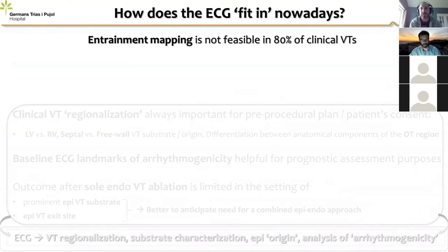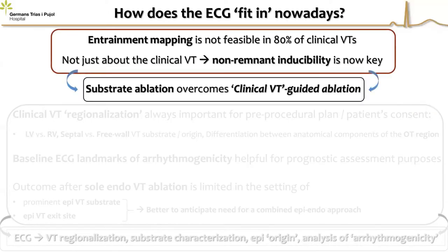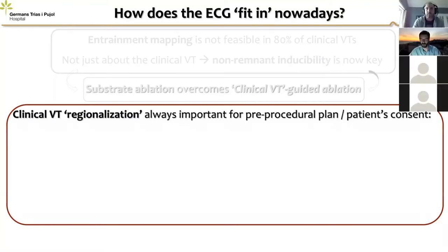To start, I think we have to accept that the use of the EKG is nowadays limited in the field of VT ablation, because we don't usually pay so much attention to the clinical VT, because now the VT ablation procedures are focused on substrate modification, and this technique is overcoming nowadays a more clinical VT-guided ablation. But even in this situation, I will try to justify during this talk that the use of the EKG of both VT and baseline rhythm is still important. And I will tell you why.